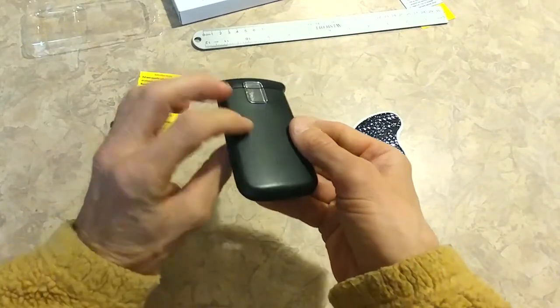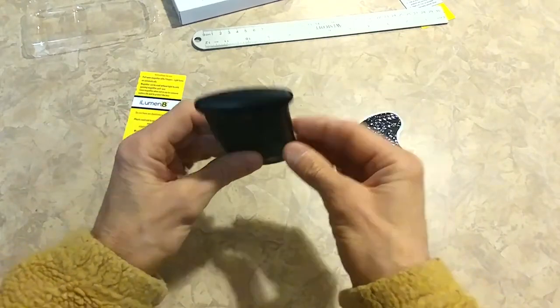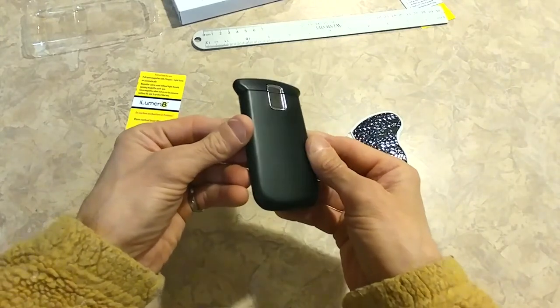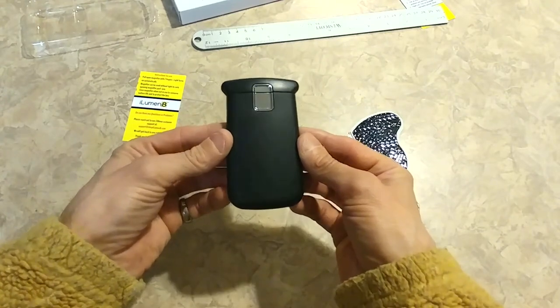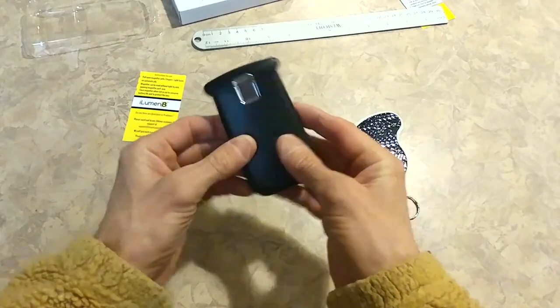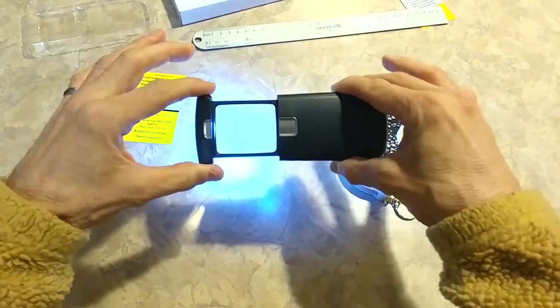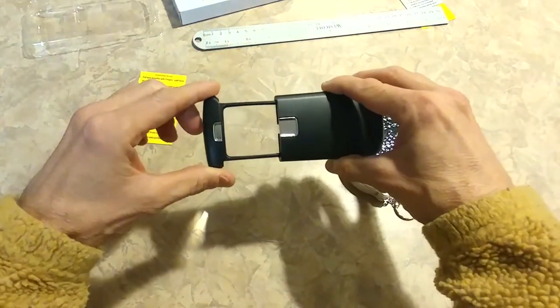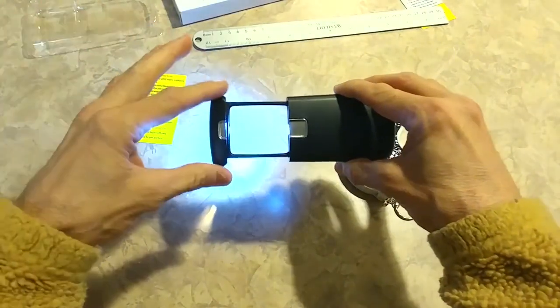Most customers buy these in pairs — they keep one by the bedside and one in the car for traveling. Really a nice looking design. No one else has this. It's just really elegant. Very simple to use, no buttons — just pull it open. If you don't want the light, you just go almost all the way open and the light doesn't come on. Go a little bit more and it turns on.